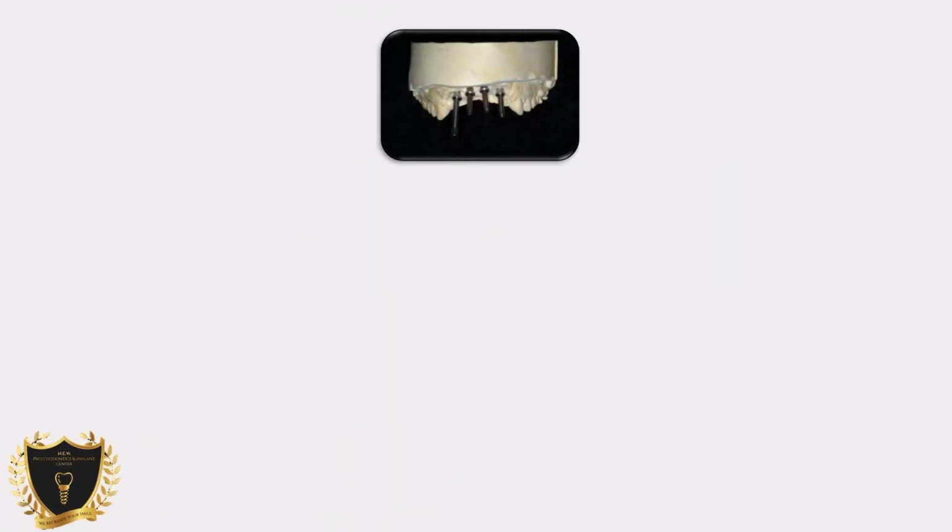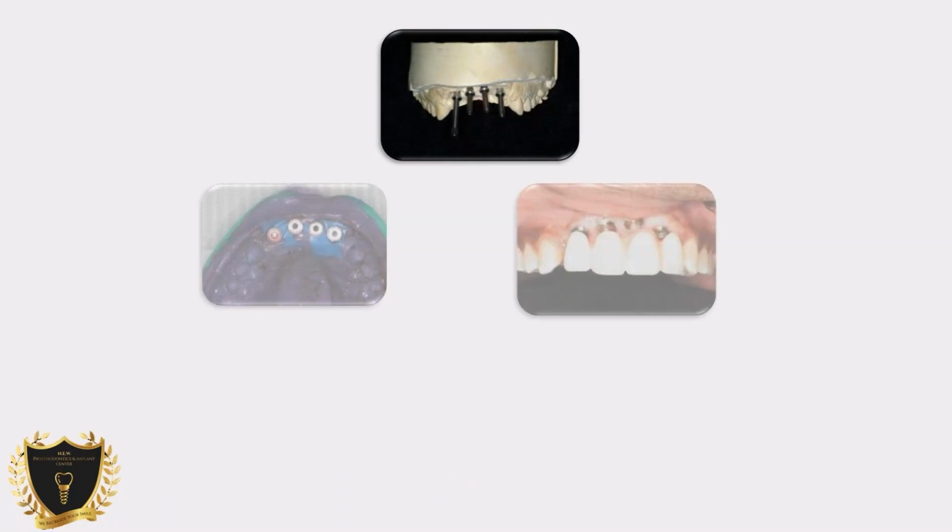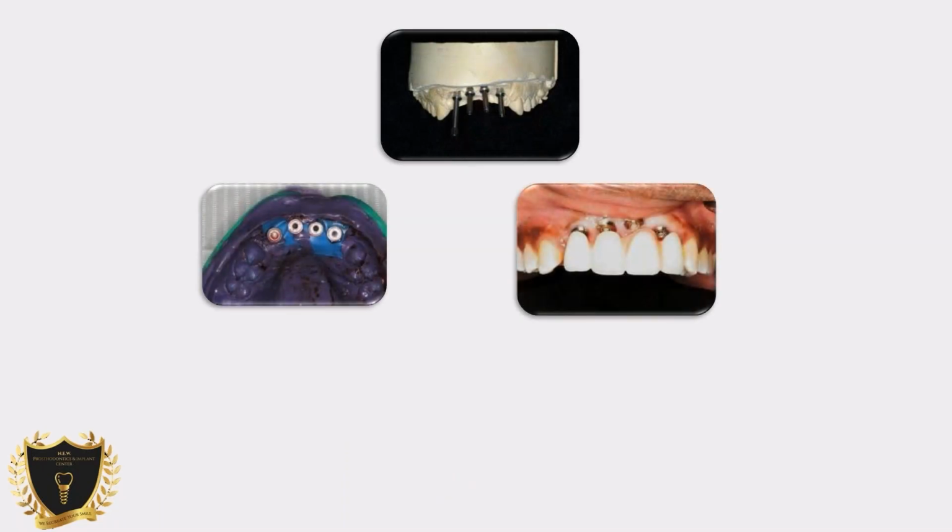If we don't, we can end up with something like this. You send a case to a surgeon and you just get 4 implants placed wherever they can find a spot. In a case like this, an aesthetic case, what are you going to do? You need to place implants where they're needed prosthetically.